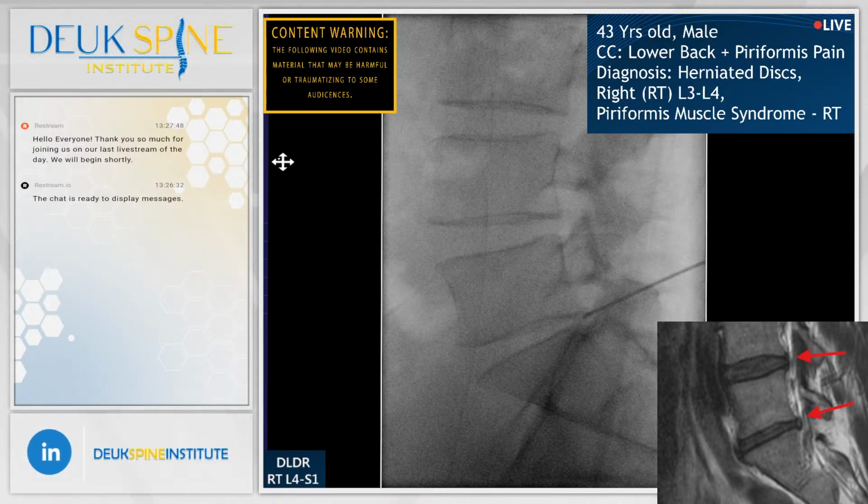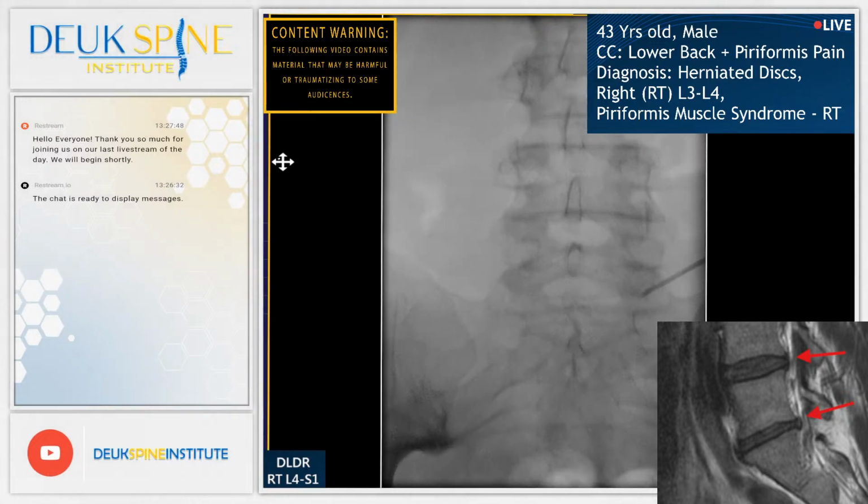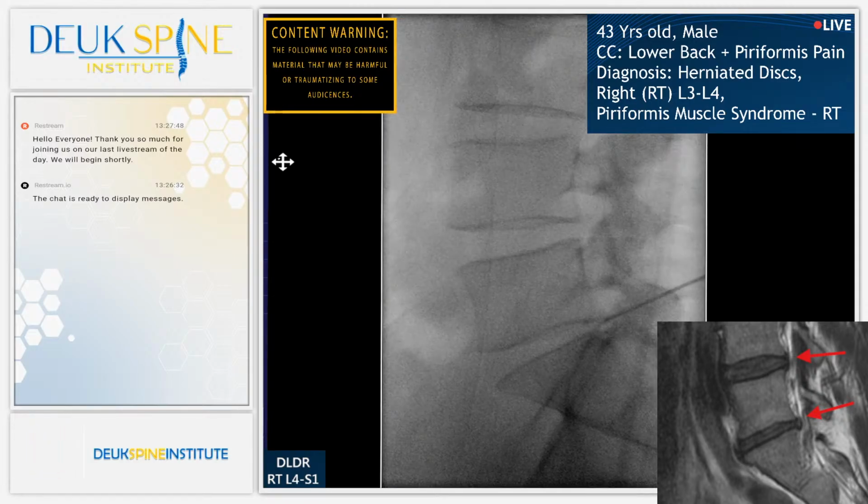I'm going to numb up the skin a little, so we're going to make an incision in just a moment. Once I am done at L5S1, I'm going to move on to 4-5. Yeah. I actually feel like looking at that image, it's possible. Lateral shot. All right. Well, I may have to get in later on when he's more asleep. Shot.